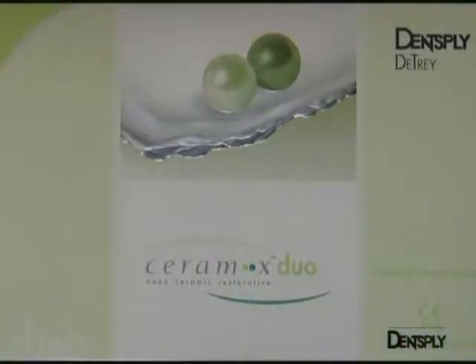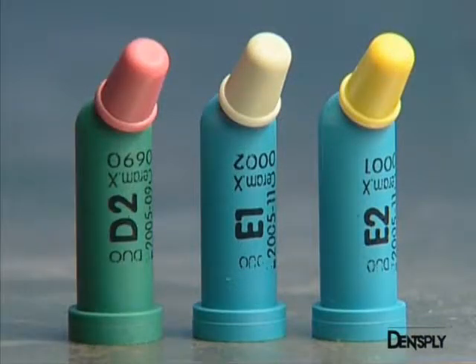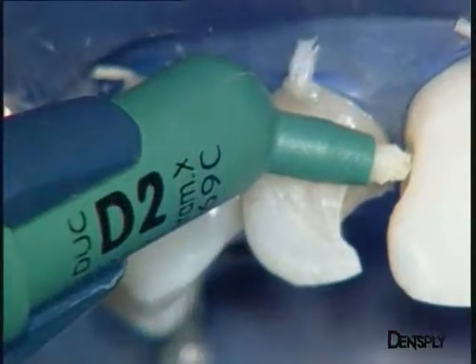For the stratification, Ceramix Duo provides the choice of two materials with different translucencies. The first is a dentine replacement material, in this case D2, in the green compule. The other is the enamel replacement material, in blue compules marked with E1 and E2.